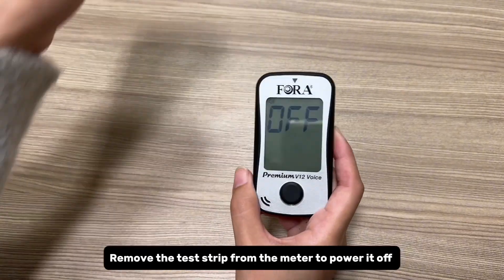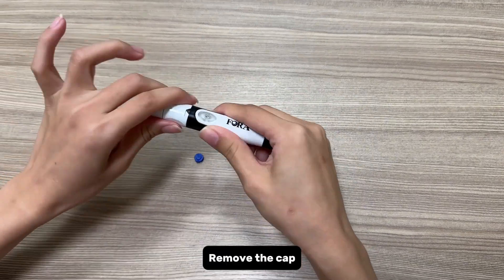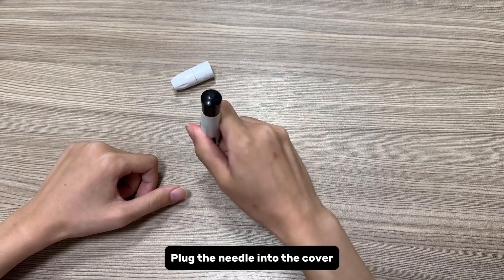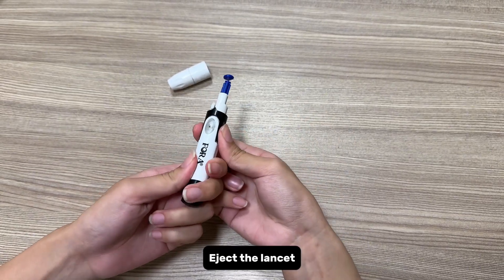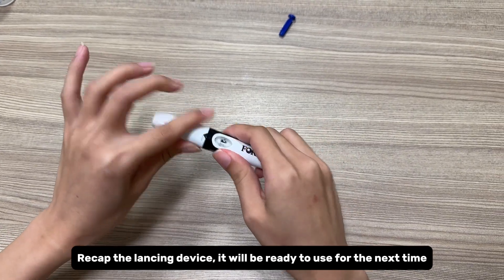Remove the test strip from the meter to power it off. After using the lancing device, remove the cap, plug the needle into the cover, and eject the lancet. Recap the lancing device — it will be ready to use for the next time.